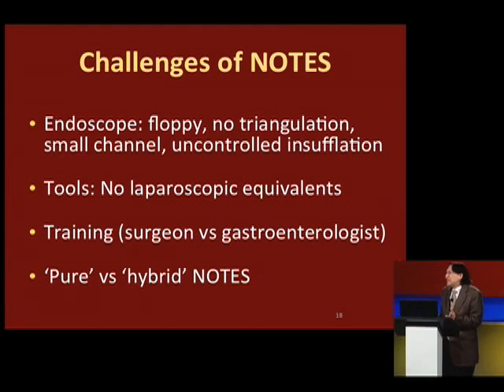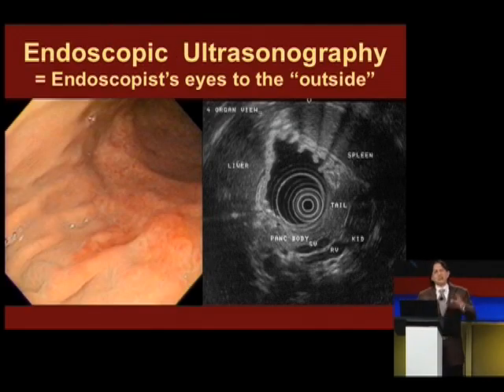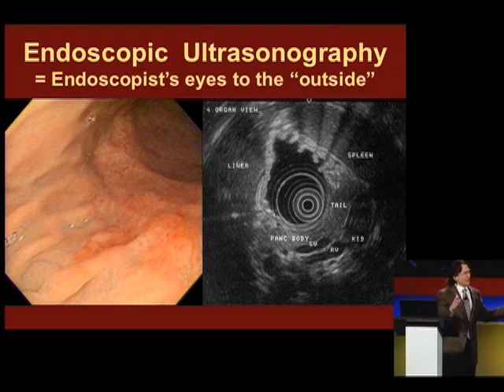Training issues. The surgical and the gastrointestinal endoscopists are really 2 different breeds. They have different skill sets. And then there was a little bit of bait and switch here. It wasn't really a pure NOTES after all. It required an accessory laparoscopic port, and that highlighted the limitation of NOTES, but it also diminished the attractiveness of NOTES.